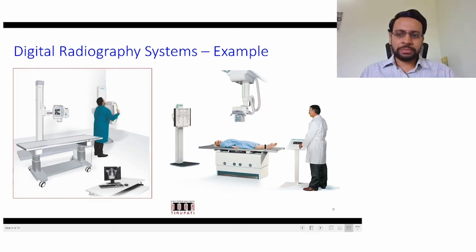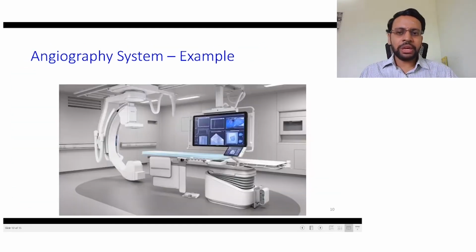This is another setup where the patient would be lying on a table, and you have the X-ray source here, and all the recording is done here. And of course the control will be somewhere in a different place, from which it can be inspected and monitored, and parameters also can be controlled.